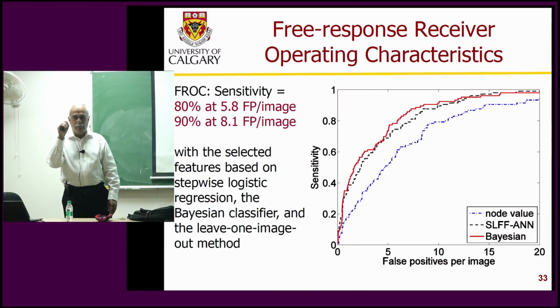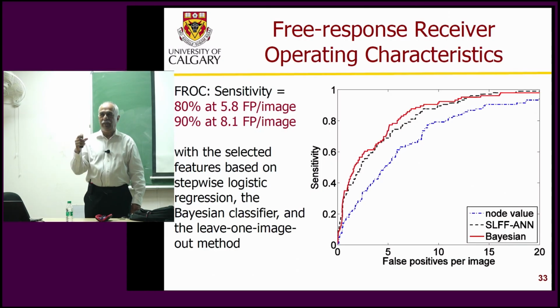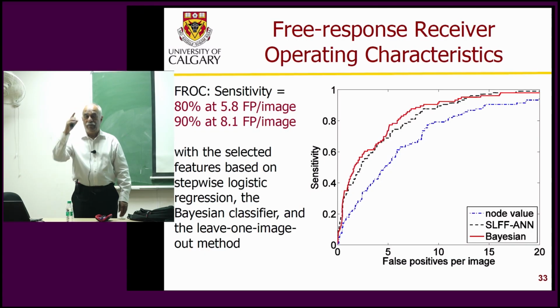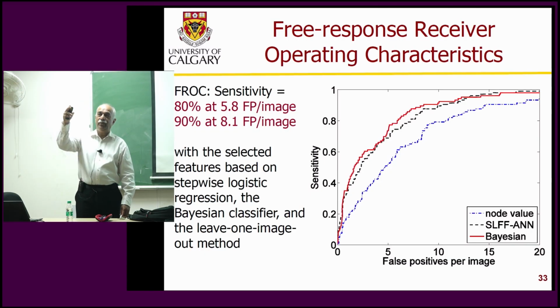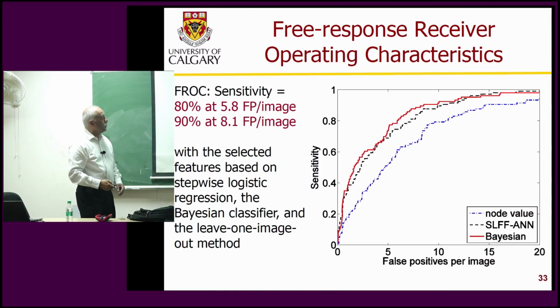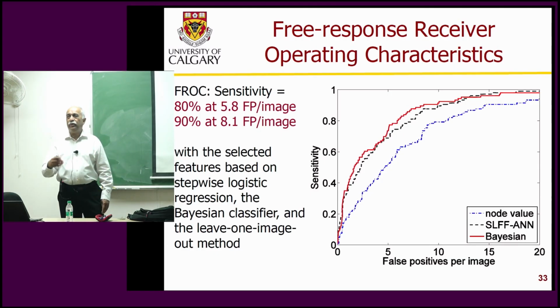I could put multiple points within the region marked by the radiologist. Then you just take one. You rank order them. So if the second one detects, then the first one is a false positive, and then the others are false positives too. So you plot this against the number of false positives. How many marks that you put were false?